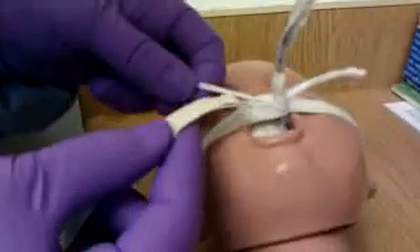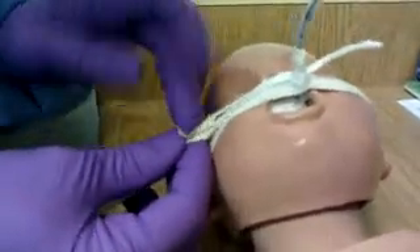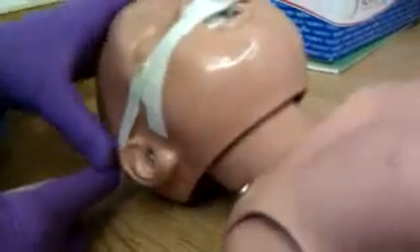And then you're going to take that tape and thread it through on the side. Flip it over and go right over the ear, around the baby's head, and then to the other side.